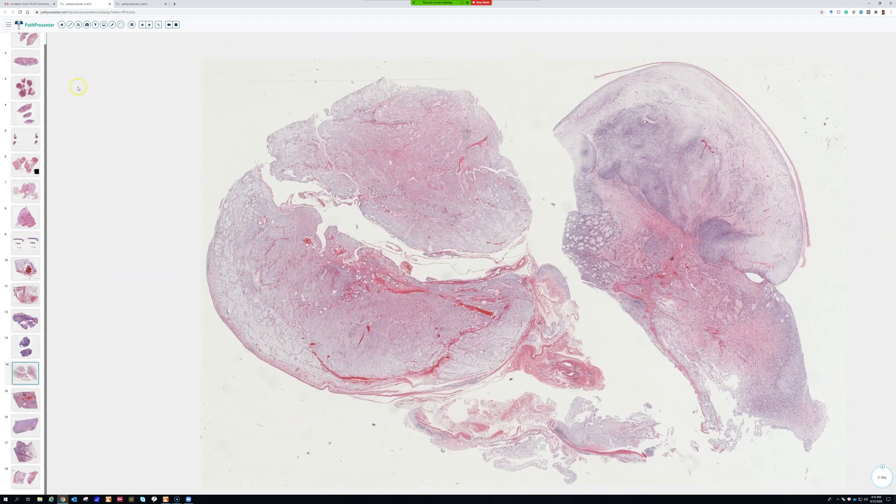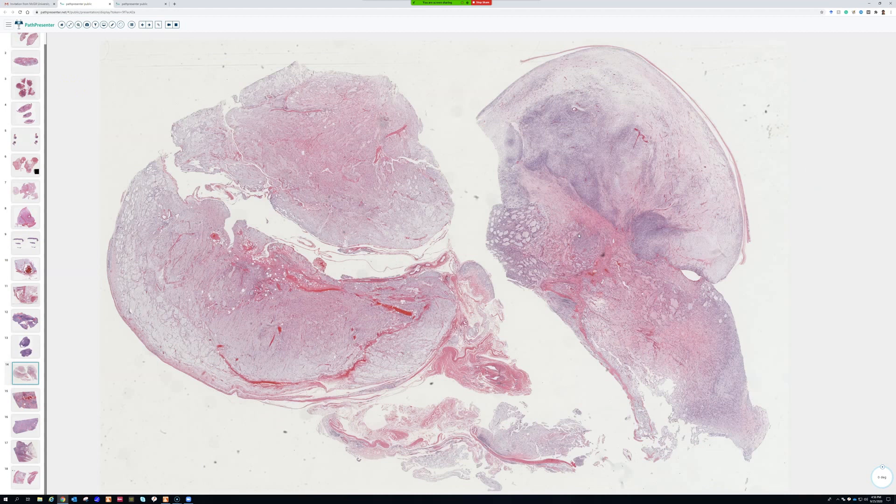Post-treatment, once these tumors have been radiated, the vast majority are just completely wiped out — all that's left is sclerotic collagen, a little vascular branchy tissue, mature adipocytes with occasional tiny lipoblasts, maybe a few pockets of myxoid change. If there was a round cell component, you'll never know because it usually gets blasted by the radiation.